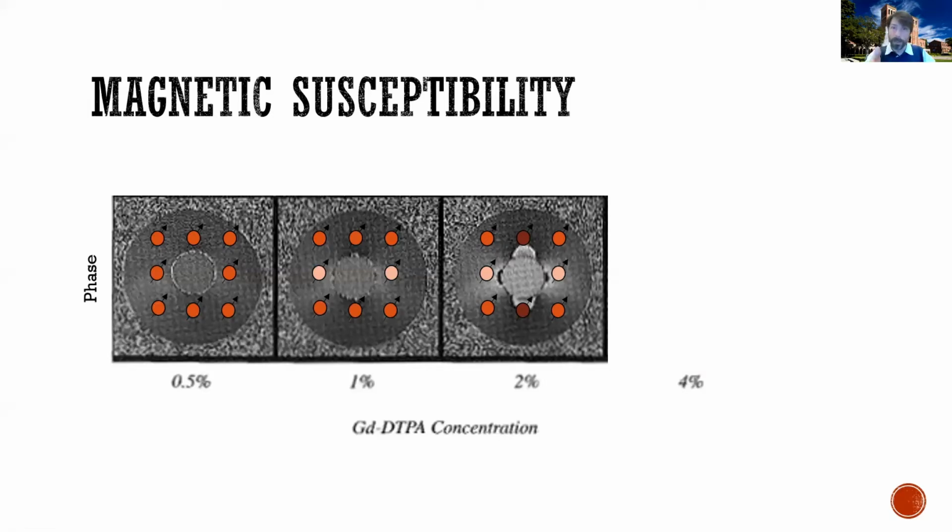So once again, we inject the radio frequency pulse, we stop the radio frequency pulse, we let protons swing a little bit, let's say 20 milliseconds, TE, and then we snap a picture and we look how strong the signal is now. Would you imagine that these would have dephased more or less compared to 1% or 0.5%? Well, certainly more, because now we have 4 protons all going at the same Larmor frequency, and then other 4 going at different Larmor frequencies.